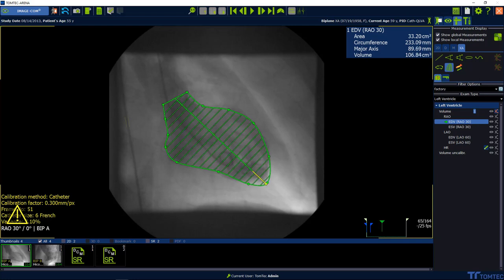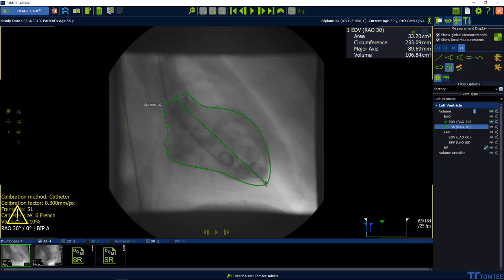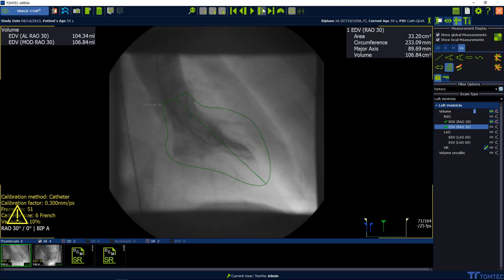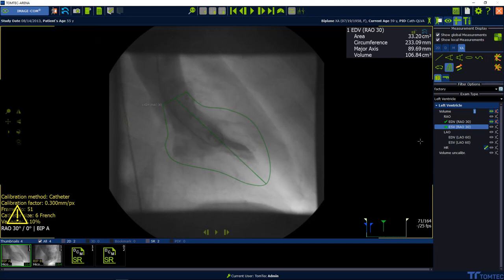Last but not least, confirm the length of the disk summation with a left mouse click. The workflow continues automatically. Repeat the previous steps for the end-systolic phase.